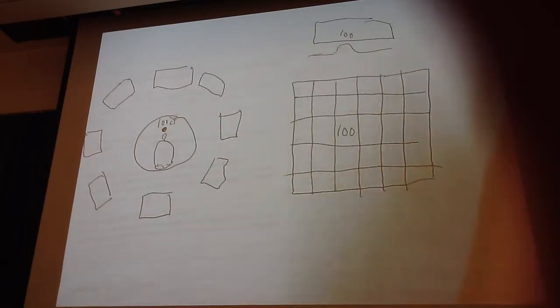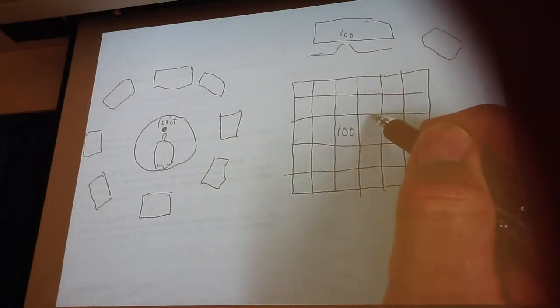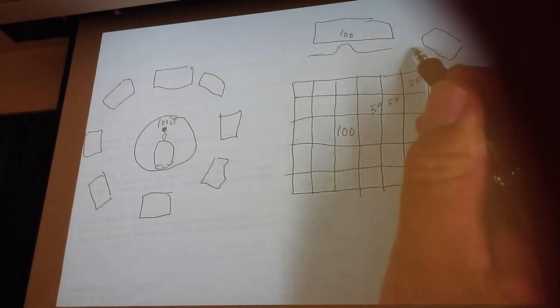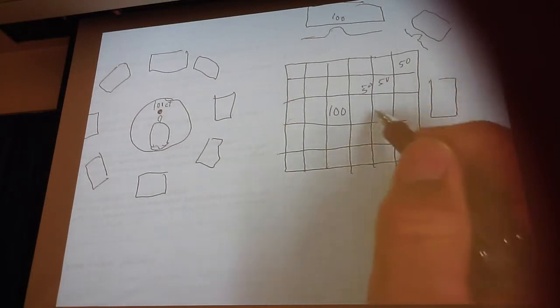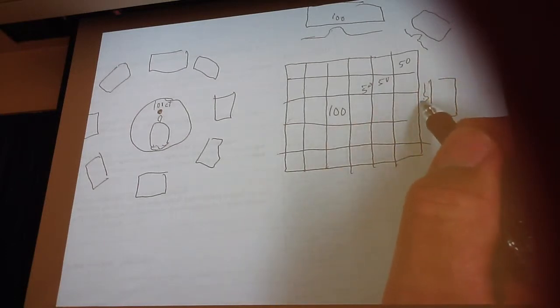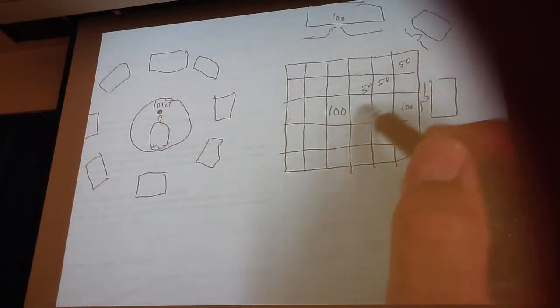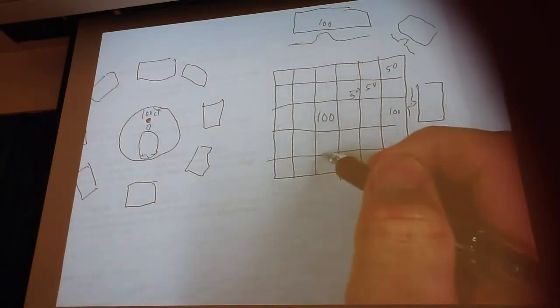So by looking at different slices here, we know there's probably going to be maybe 50 counts detected this way. Somewhere along here there's 50 counts, and then we go to the side over here, and we get another 100. Whenever the computer detects something, it's going to send that number back down that row of pixels.